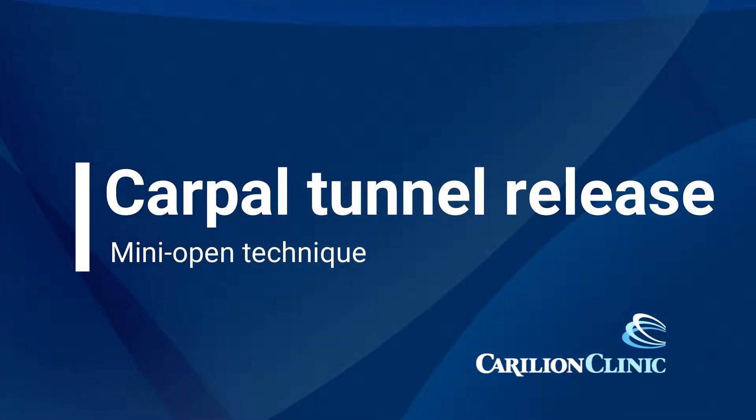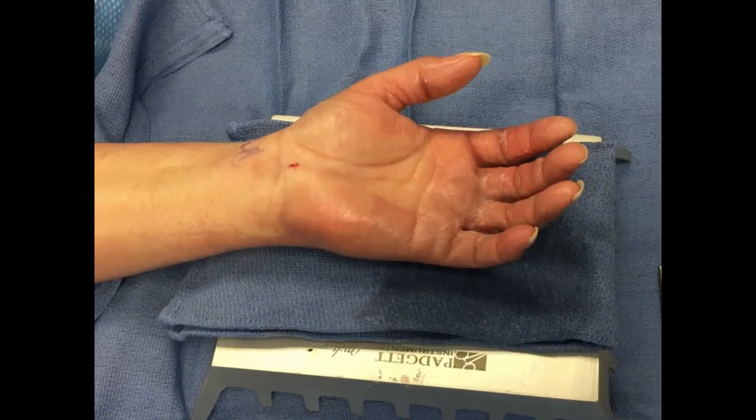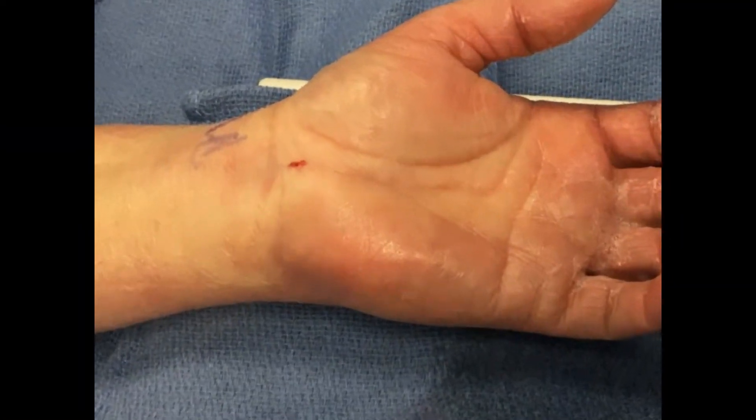In this video we'll be demonstrating a carpal tunnel release using the mini open technique. This is a left hand and the video will be zoomed in here in the palm where the incision is made.